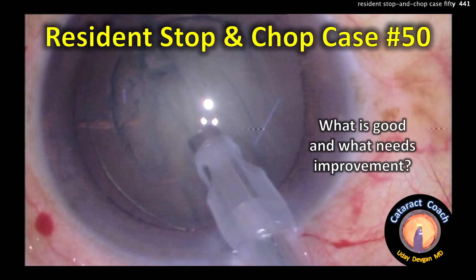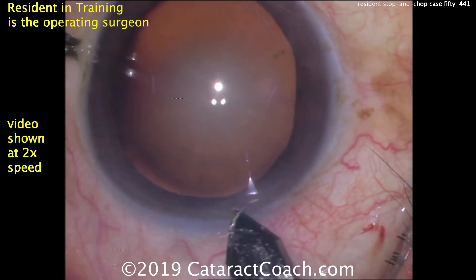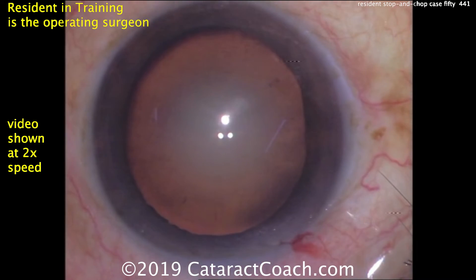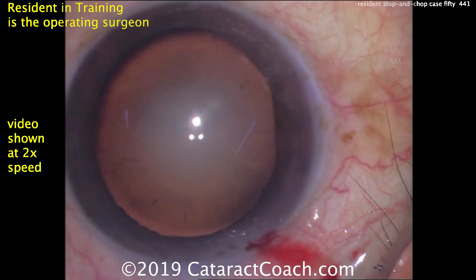CataractCoach.com resident stop and chop case number 50 — what's good and what needs improvement? We're looking at a video of a resident performing surgery. Let's look at the main incision: that's a pretty good incision, good tunnel length. I like how it nicks the limbal vessels — maybe a little on the short side, but otherwise looks pretty good.